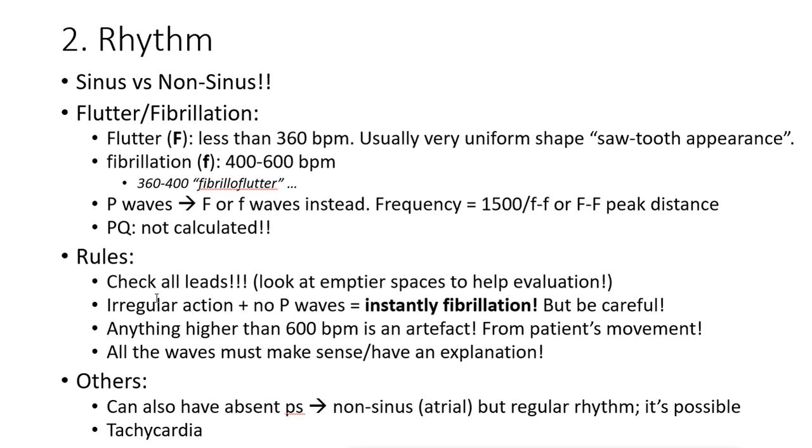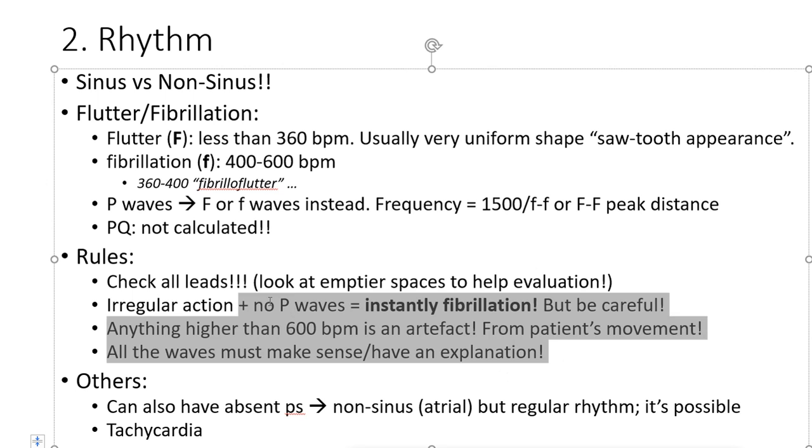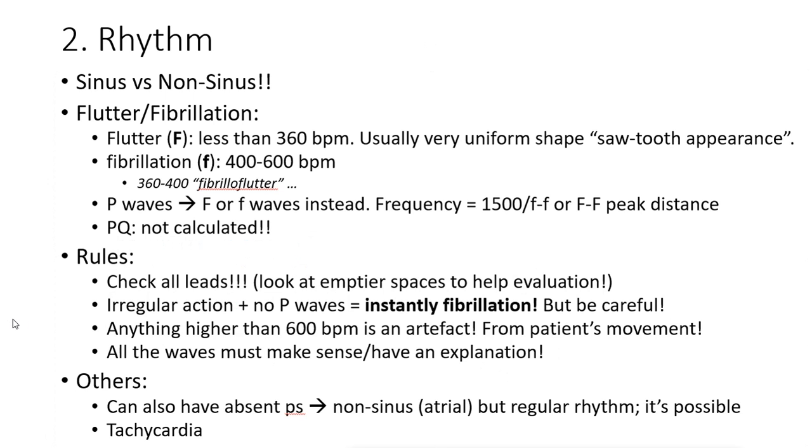If you're going through all of these points, I highlight them so much. Why? Because these will help you throughout the examples to notice some very, very hidden fibrillations that could actually end up, I'm gonna end this man's entire career, or I don't know, I forgot the meme, but allow it. I'm gonna end this man's whole career.